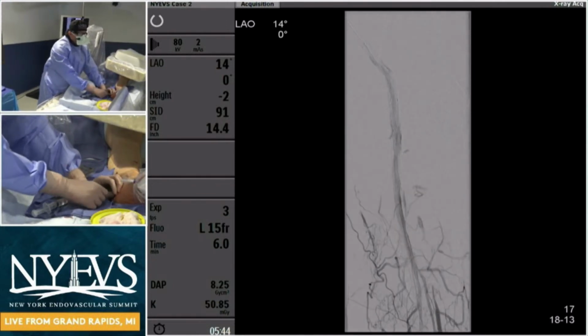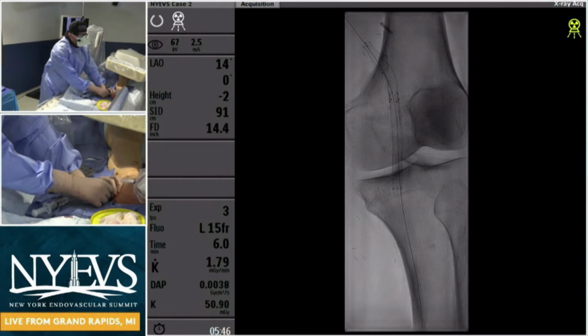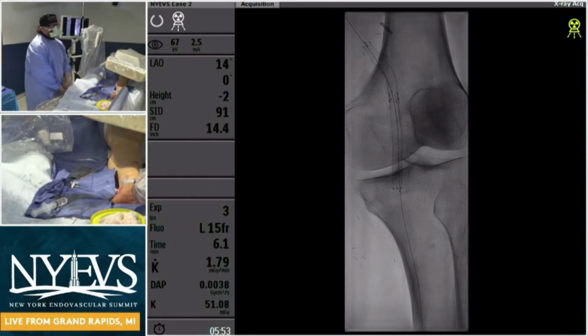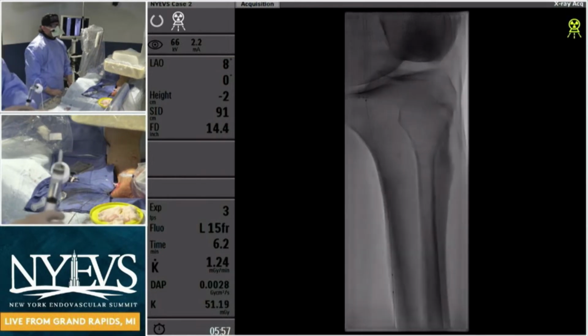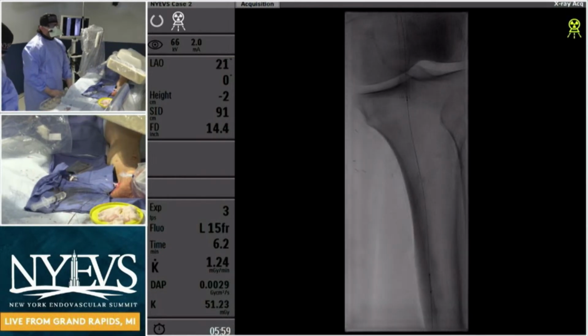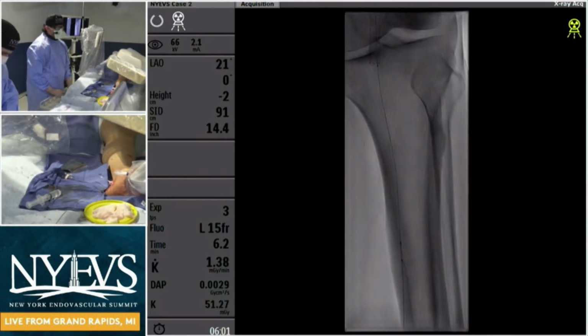That's a great point. Any thoughts on the panel? Because I know how many of you would not have done an atherectomy, would have just gone to maybe an atherotomy, say a Serranator or Chocolate, and just put a DCB in, or just direct DCB? So Dr. Schneider, go ahead, you first.